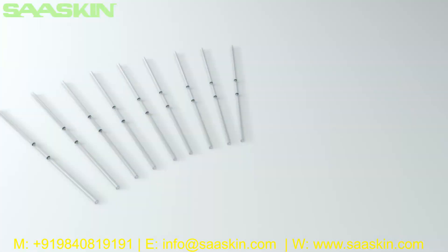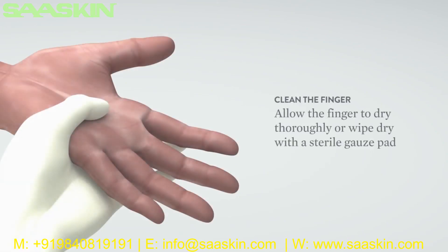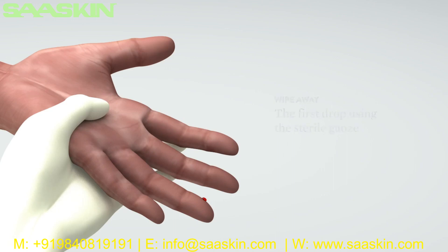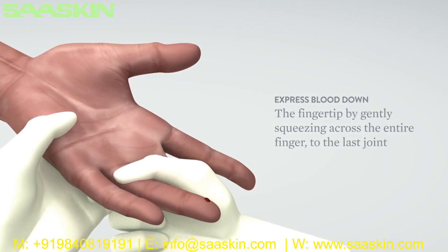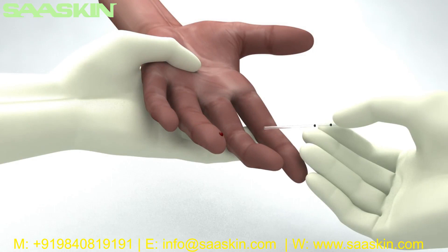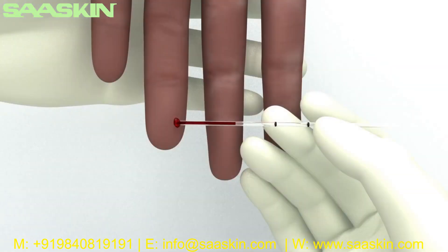Test procedure: Collect the finger stick sample using the EDTA capillary tube. Caution — the EDTA capillary tube must be used to collect the finger stick sample. Clean the finger with an antiseptic wipe and allow to dry thoroughly or wipe dry with a sterile gauze pad. Using a sterile lancet capable of producing 50 microliters of blood, puncture the skin just off the center of the finger pad and wipe away the first drop with sterile gauze. To collect an adequate sample volume, quickly express blood down the fingertip by gently squeezing across the entire finger to the last joint, not to the end of the fingertip. Do not squeeze or milk the fingertip to accelerate bleeding. Collect the second drop of blood by holding the capillary tube horizontally and touching the tip to the blood sample — filling of the capillary is automatic. Maintain this position until the flow of the sample has reached between the two lines of the EDTA capillary tube.